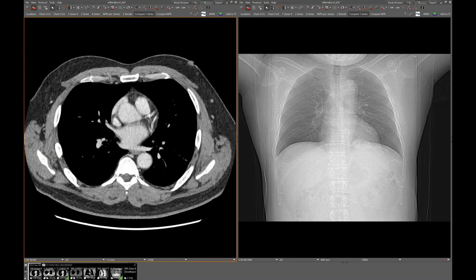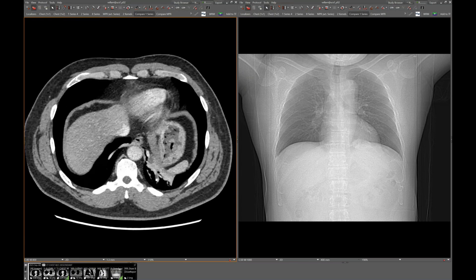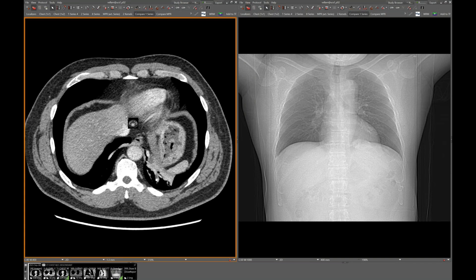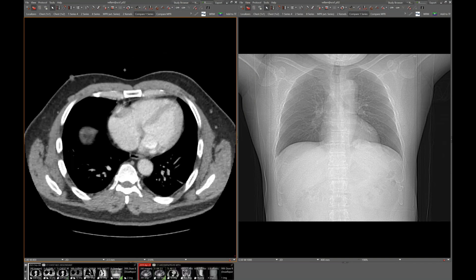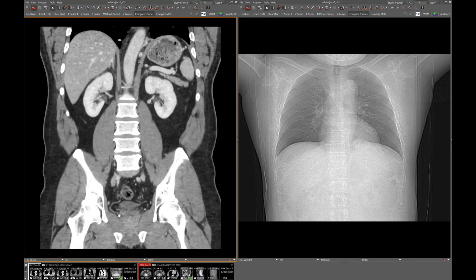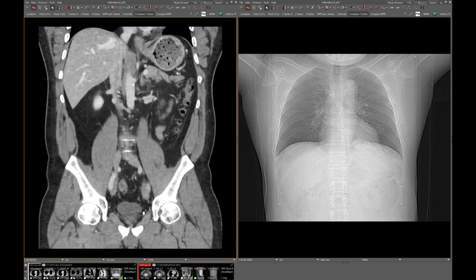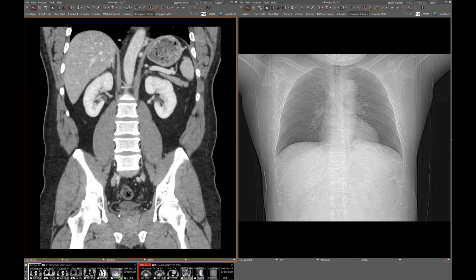There is a small inferior pulmonary vein on the left with a common posterior antrum where they come together at midline. The sequestration just used whatever vascular supply was available — it was all one big blob of cells developmentally. Credit to abdominal radiology colleagues who originally called this on an abdominal CT several years ago, although they didn't share it with the chest team at the time.